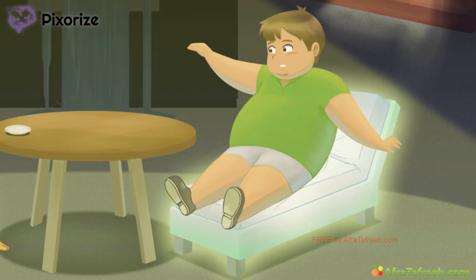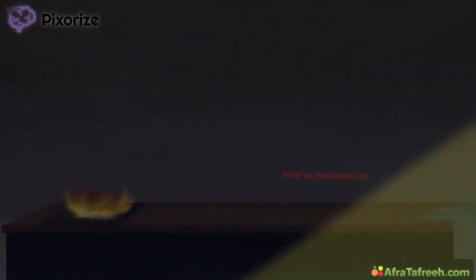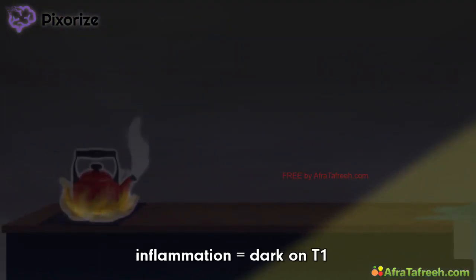So now that you've listened to the boring stuff, I'll give you what you really want. What's bright and what's dark. Let's start with dark on T1. Turn your eyes to the counter at the back of the room. Whoa. Looks like somebody left this kettle on for too long. This fiery kettle should help you remember inflammation. And it's in the dark part of the kitchen to help you remember that inflammation is dark on T1.